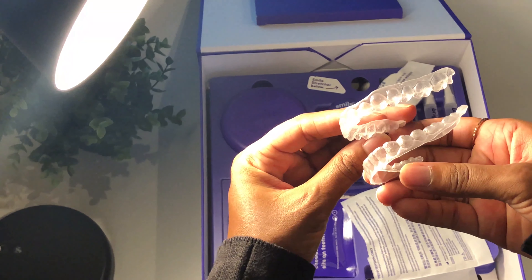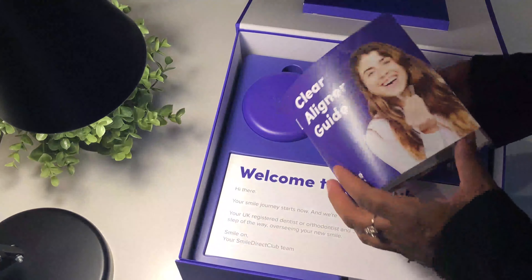What kit will you receive? After I had the consultation, six weeks later I received a box with the aligners in them, and a booklet or leaflet that had all the information regarding the plan.